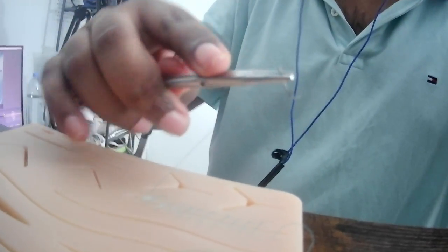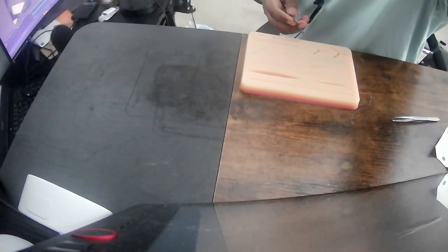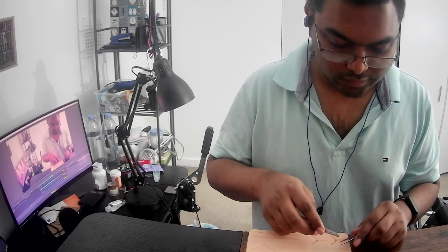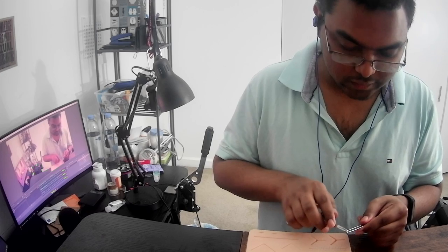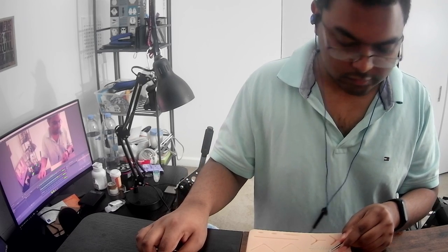And you need to get very creative with your wrist movement and the way you drive with your index finger. Gotta be careful. And then you need to make sure you dig deep enough, and it needs to be a nice and even semicircle as you drive through. Okay? I think that's how it's done. But, yeah. How long did I practice? For like an hour or something? I don't know. You gotta start somewhere, right? So yeah, this was day one. Progress.